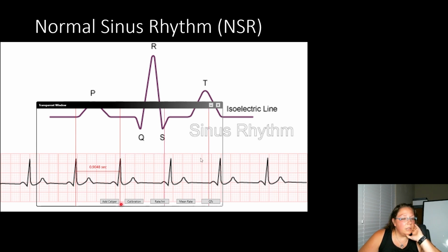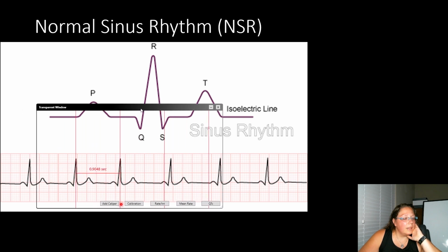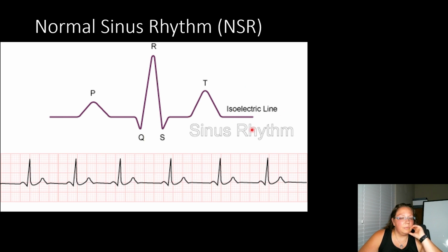What it'll do is it should line up with each other. There you go. It looks like it's speeding up actually. This also has the function that you can figure out your rate, but I have to figure that out. Maybe by next week I'll have that figured out.